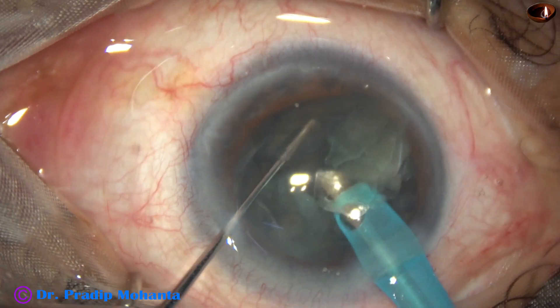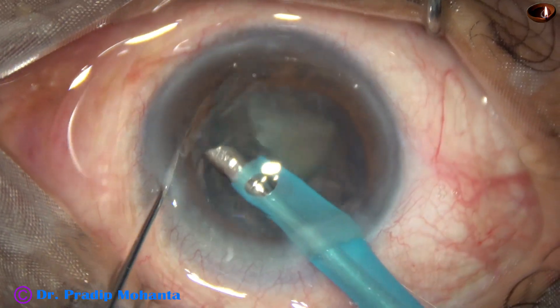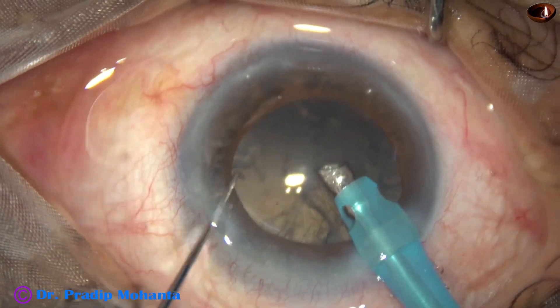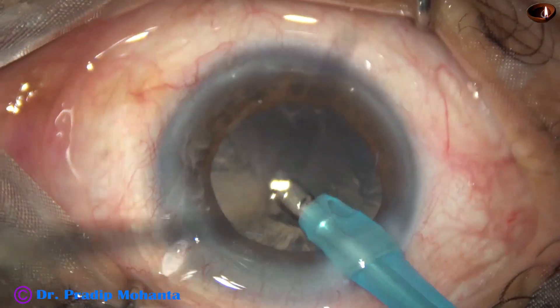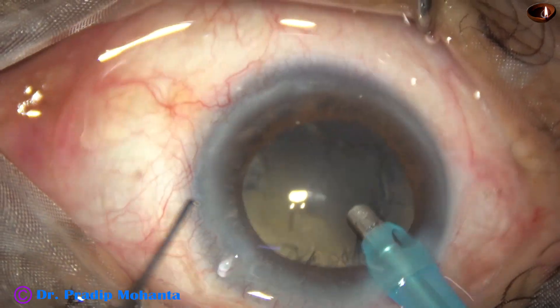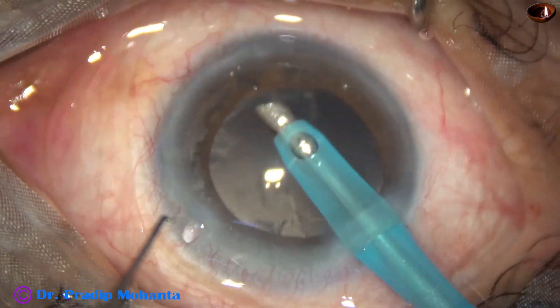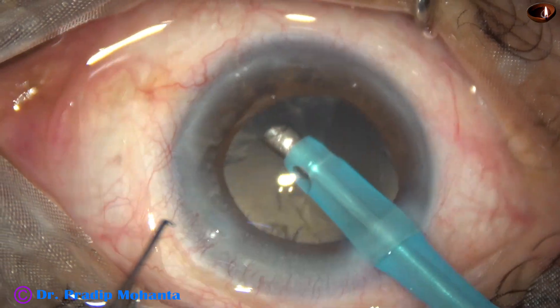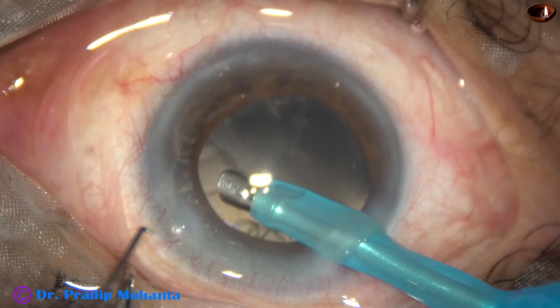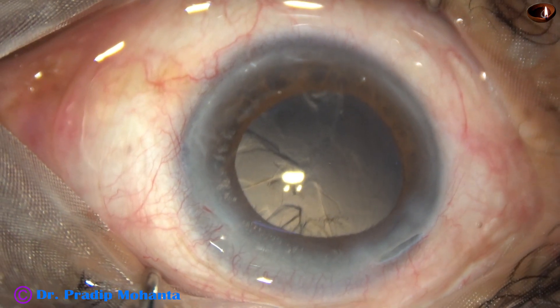The other hemi-nucleus is pierced at its middle, chopped into two pieces, and the lens matter is emulsified and removed. The nucleus and epinucleus are out. A portion of cortex is also removed by the phaco needle, though removal of cortex by the phaco needle is not recommended for beginner surgeons — only try this once highly experienced, and at your own risk.